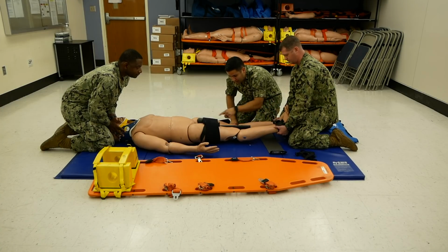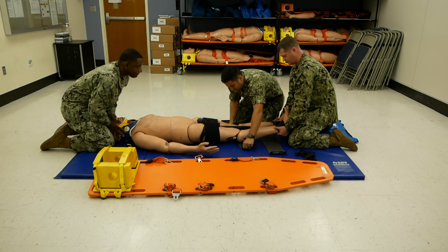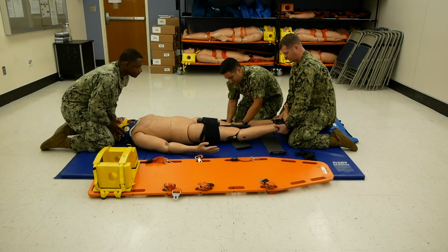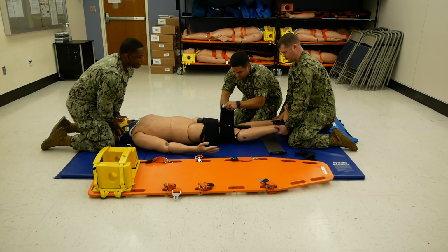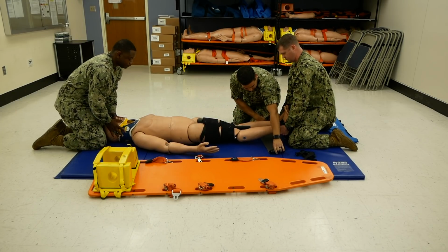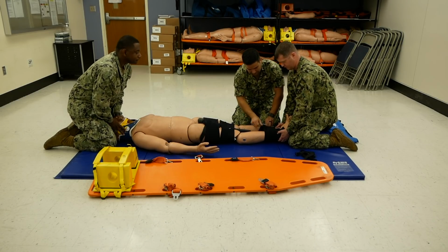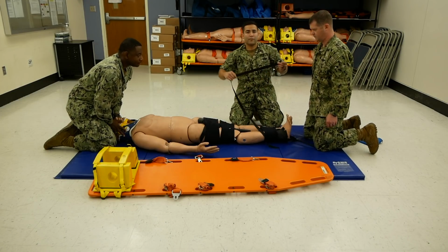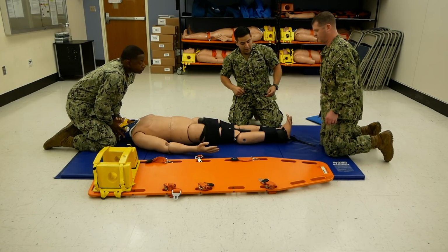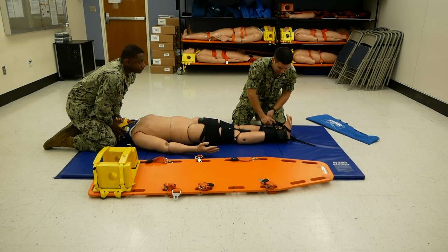First cravat goes high up to secure the top. Second cravat goes just below. And third cravat secures the lower extremities. Once all 3 cravats are in place, go ahead and place the figure 8 around their feet to secure their feet together.